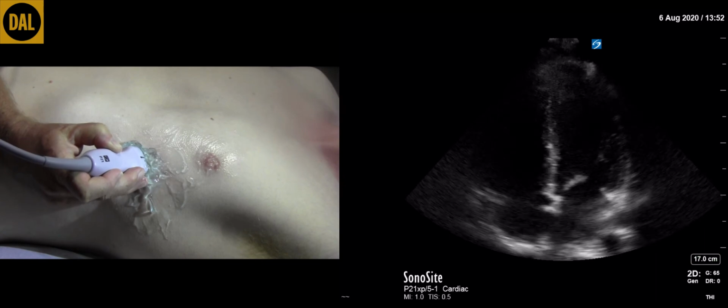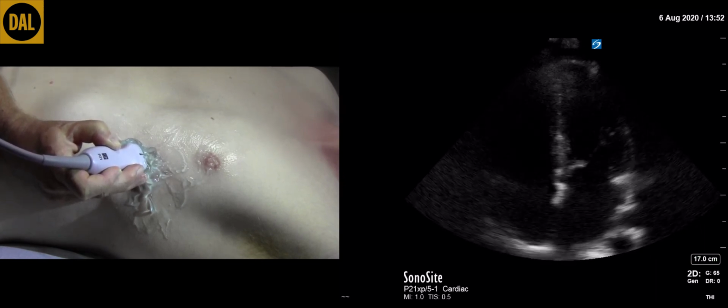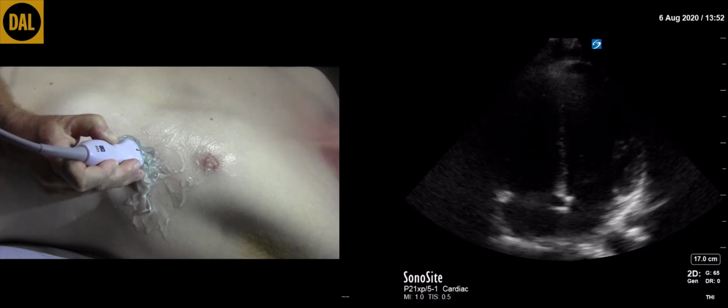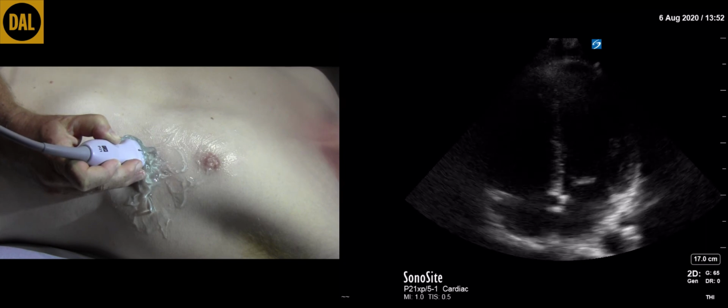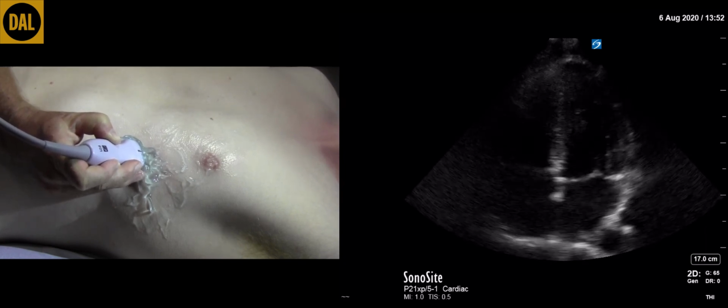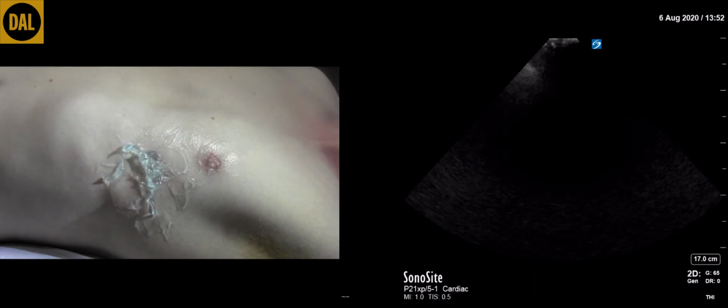Small adjustments to transducer slide, rock, tilt, and rotate can be used to generate the optimum image. In some patients, it may be necessary to roll the patient onto their left side to improve the image. Also note that image quality may change during the respiratory cycle. This completes the apical 4-chamber view.